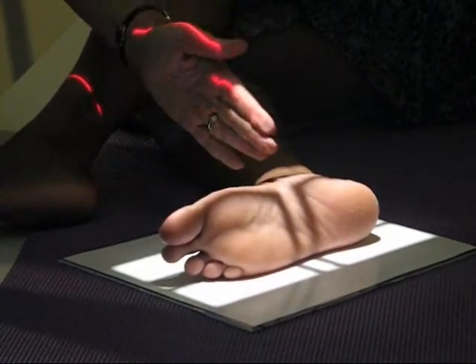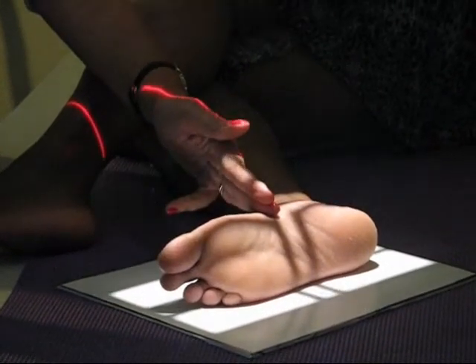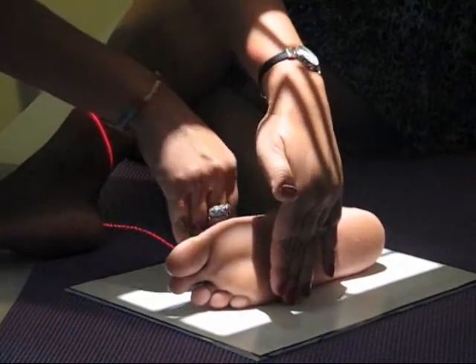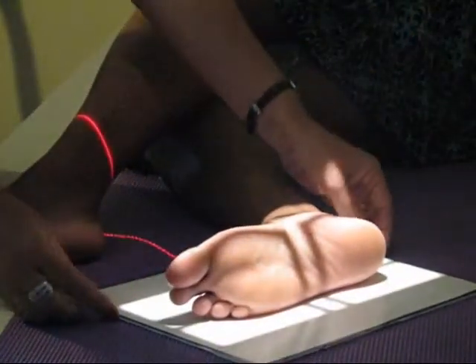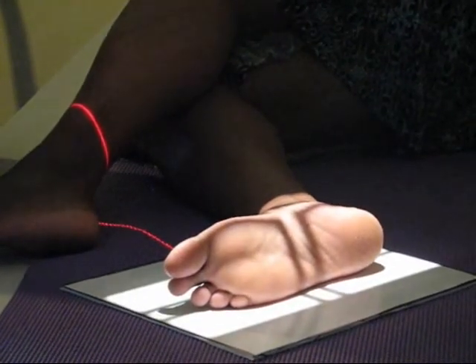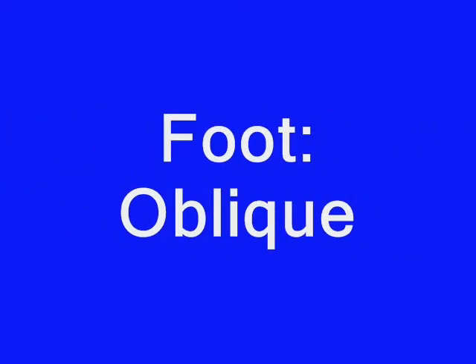Again, your CR is going to be about the base of the metatarsals, so in the middle of the foot. You want to make sure that your foot is at a 90-degree angle as much as possible, and that you don't cut the toes. So you're going to be careful with the collimation.